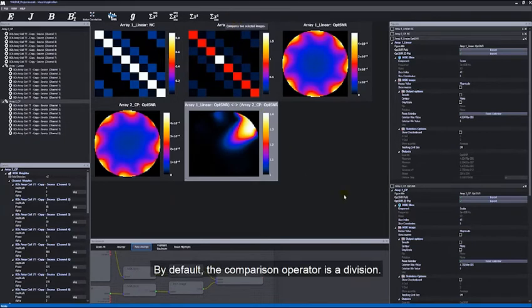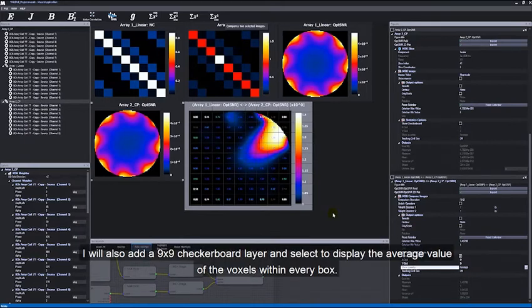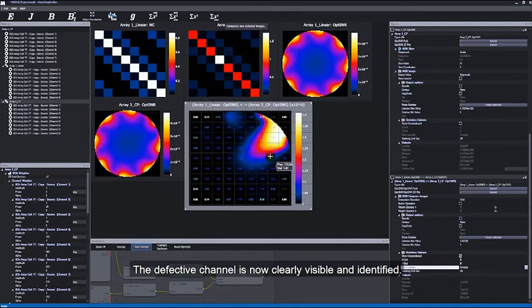By default, the comparison operator is a division. I will also add a 9x9 checkerboard layer and select to display the average value of the voxels within every box. The defective channel is now clearly visible and identified.